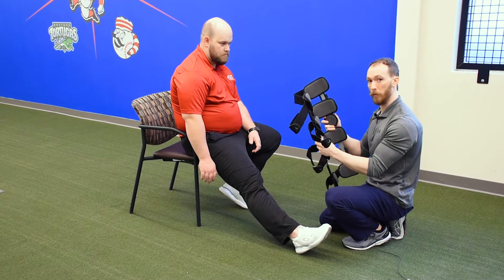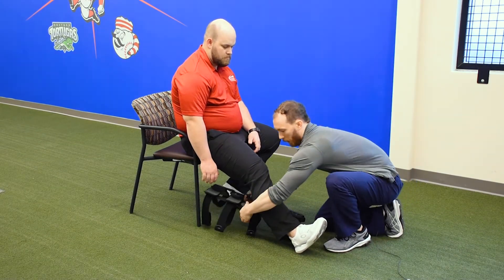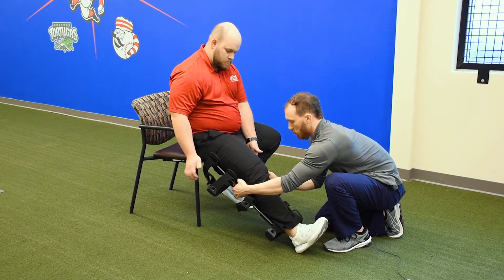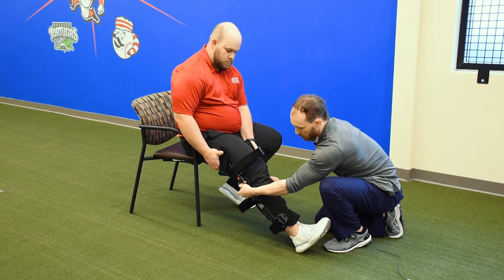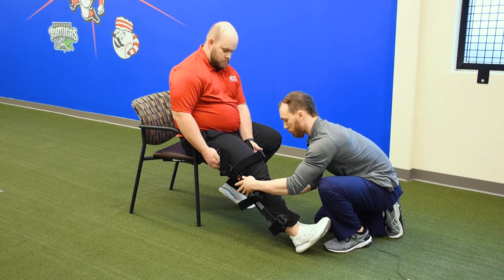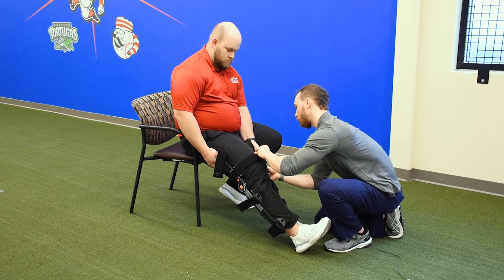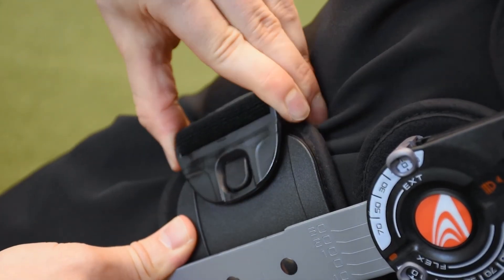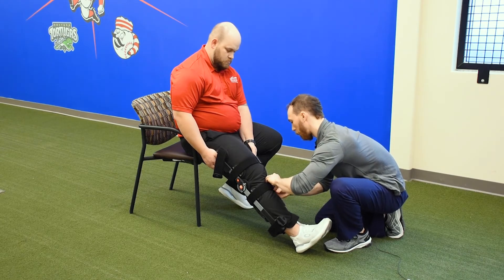Now we're going to show you how to put on the post-op knee brace. We'll wrap it around the back side of the leg. We want to make sure that we get these condyle hinges lined up with the knee, and then we'll start with the clips. They're just going to slide into the hook closure and slide back towards the outside. You'll do that with all four of these.